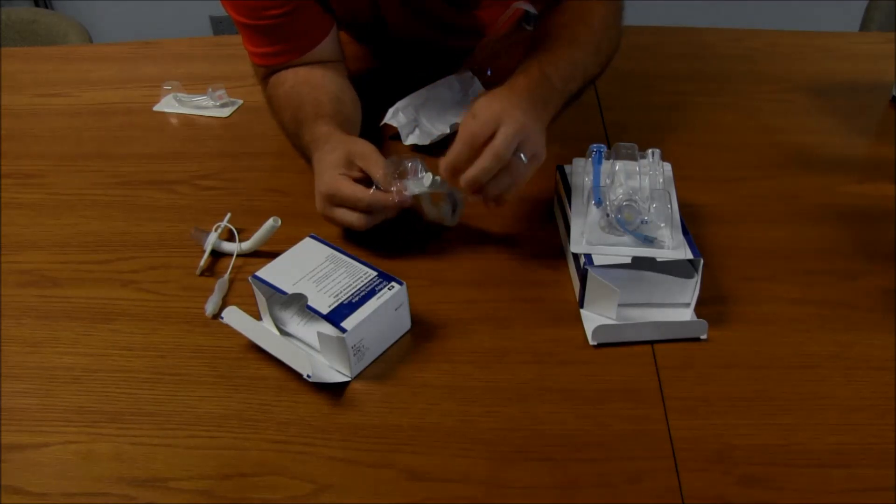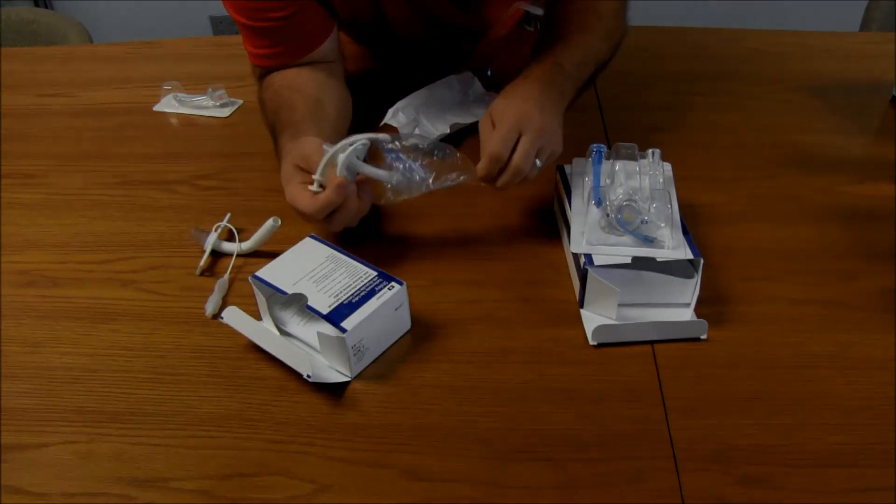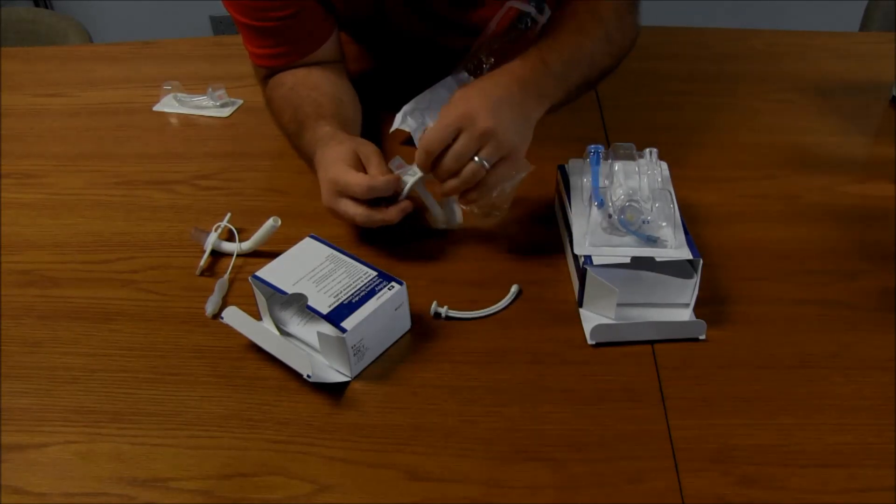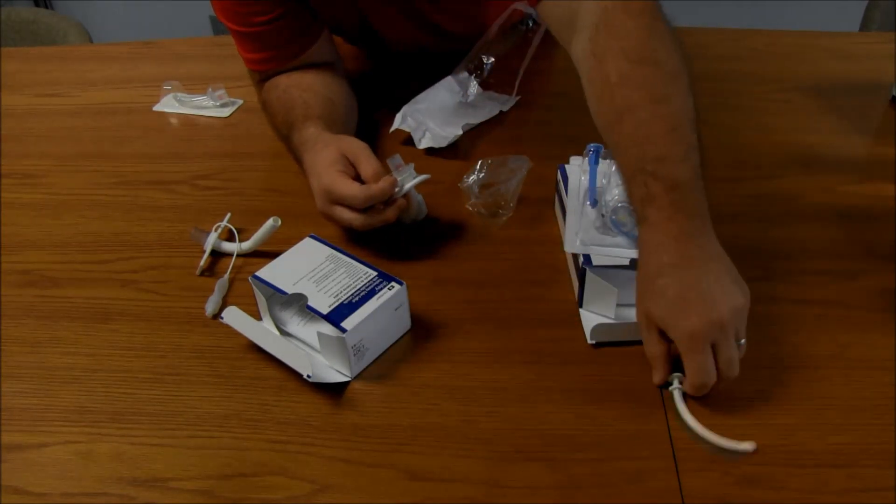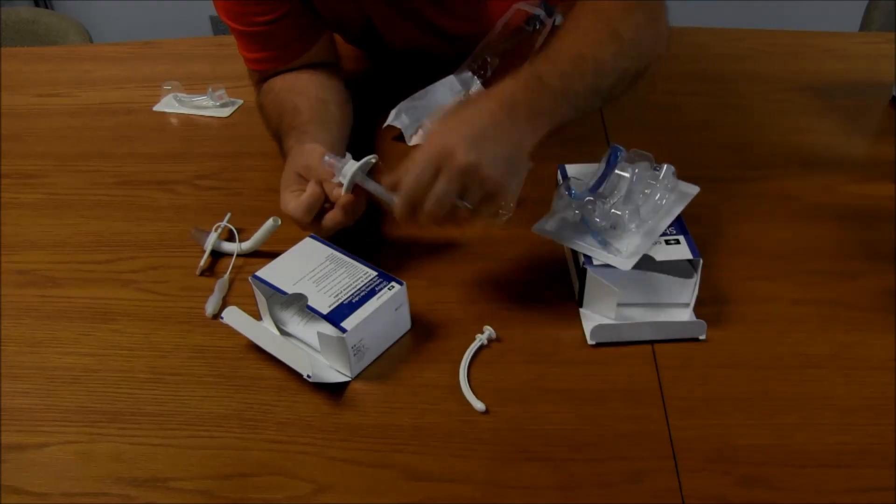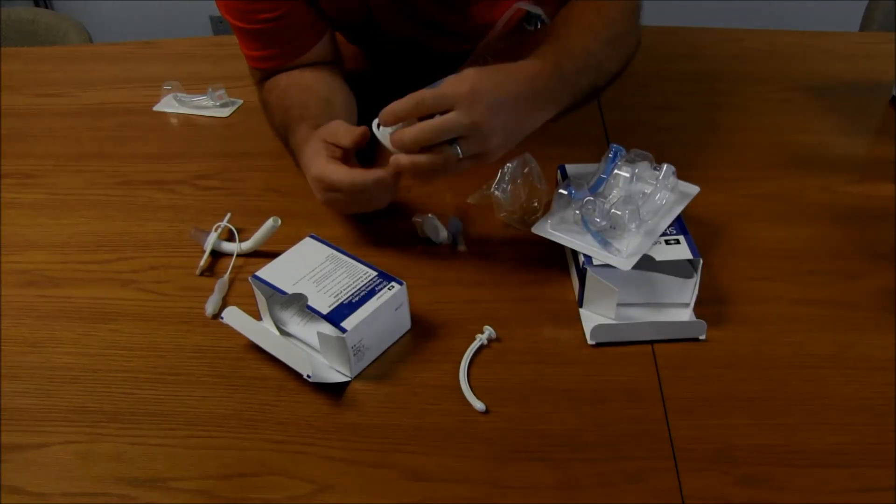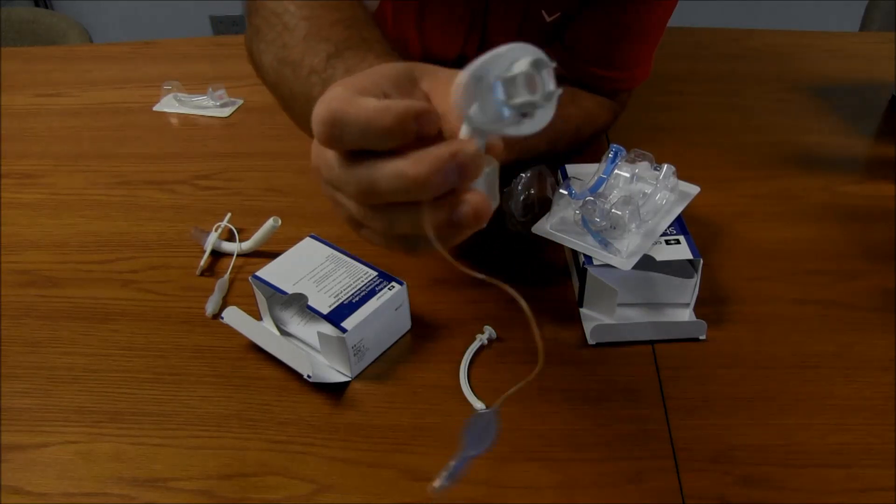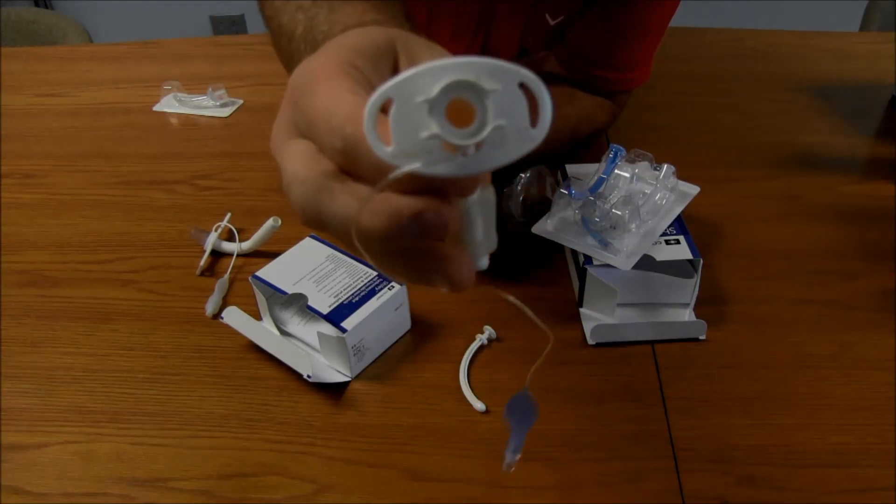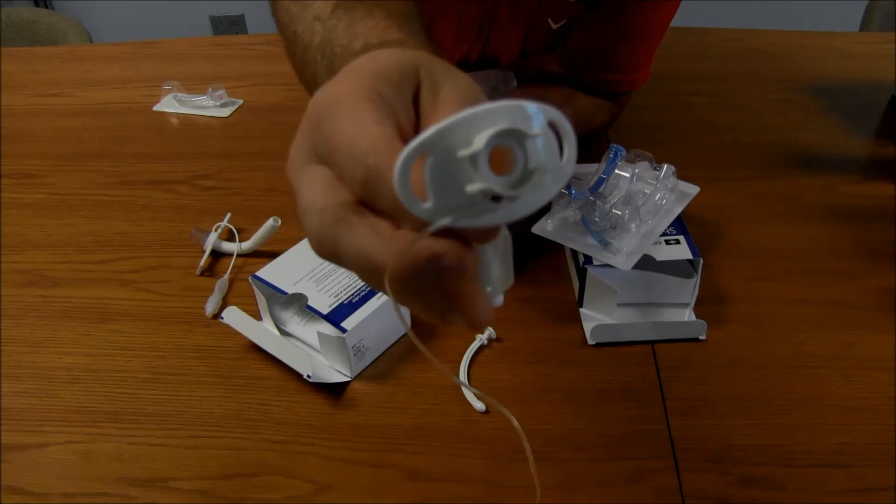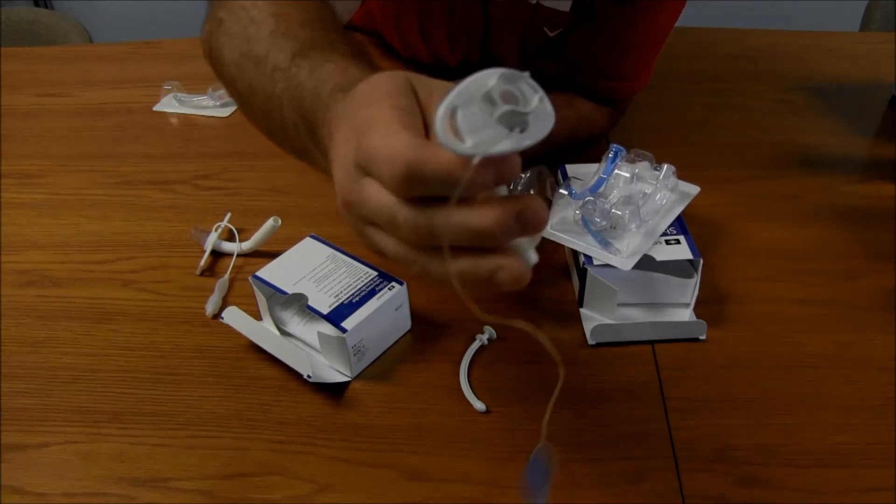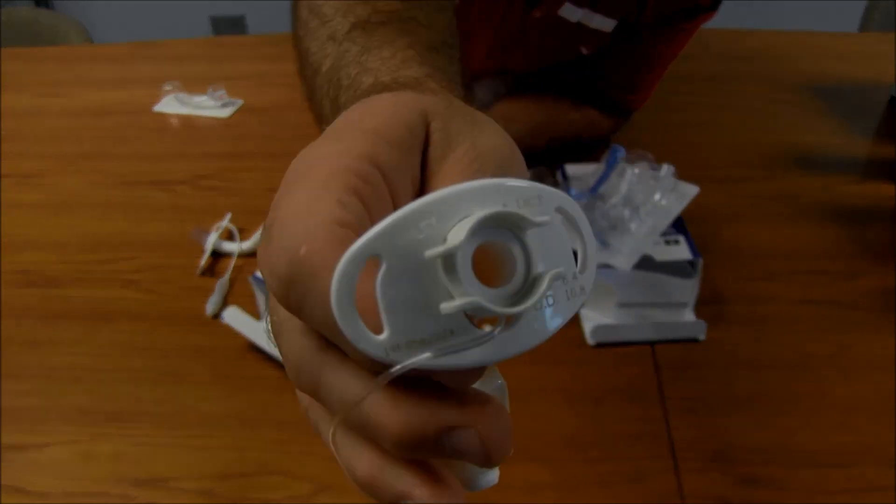They come with the same equipment each time. So, we have our introducer. We have our tracheostomy. As you can see there, 6 DCT. And that inner diameter is 6.4. Outer diameter, a 10.8. That's really important to look at. When you're looking at these trachs, what the outer diameter is.